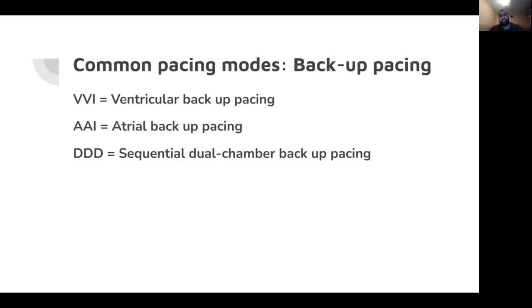Any of these things. DDD requires a longer explanation, and I'll get into that. But the concept of DDD pacing is to stimulate both the atria and ventricles in order to replicate a kind of more perfect physiological scenario.